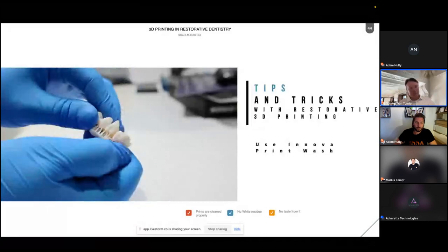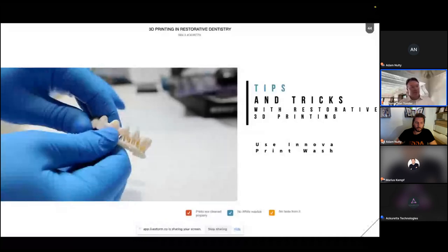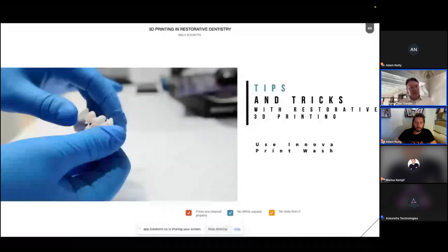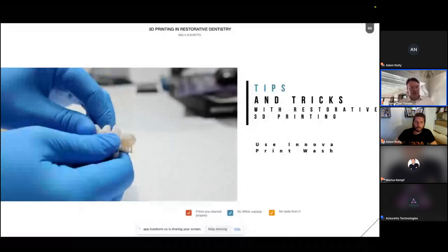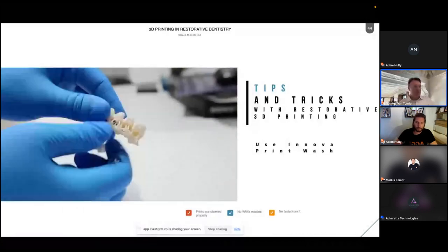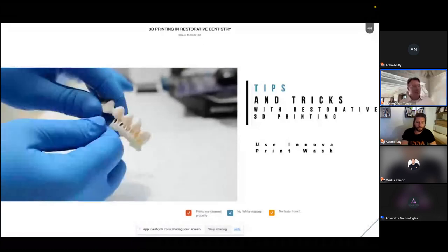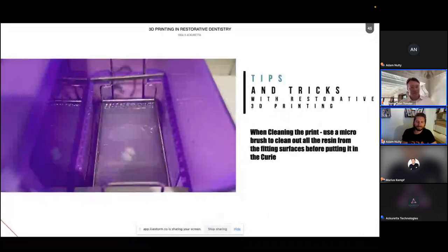Patient is properly consented, and it's been in the mouth now for 8 months, and it's working fine as a long-term provisional. But that's definitely not an indication of the material. And Marius, you can switch on again now. We can go to the next slide.